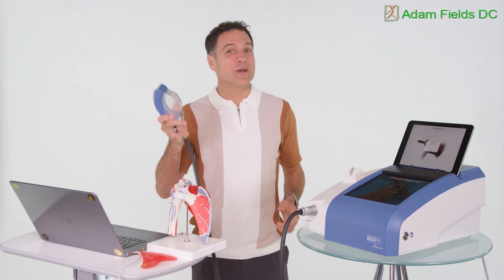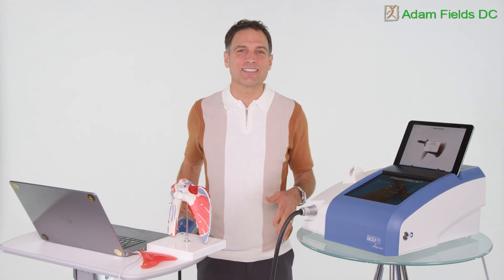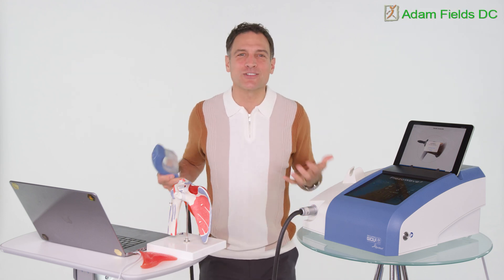Let's team up with the piezo wave, manual therapy, and some rehab exercises and get you feeling like you could pull a tree out of the ground.